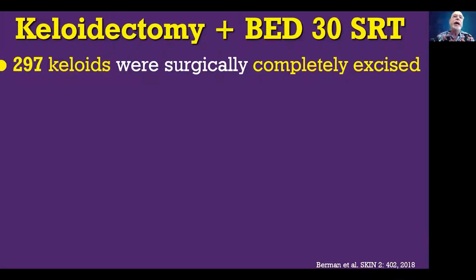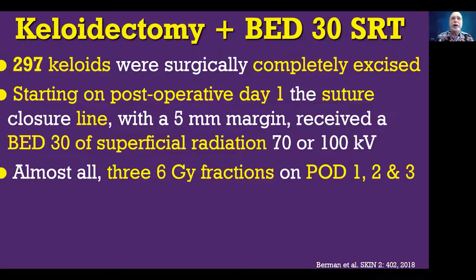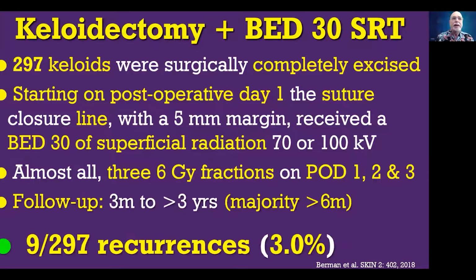We then undertook a questionnaire survey of 297 keloids that were completely excised. Starting on postoperative day 1, the suture line and the 5 millimeter margin were exposed to a biologic effective dose of 30. The percent of patients that had recurrences was 3% of the excised keloids. Now, this study was a survey study and it included some relatively short follow-ups.